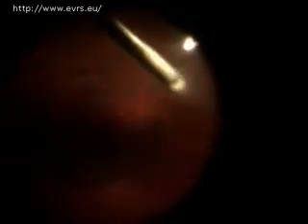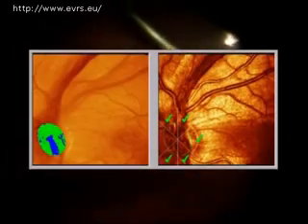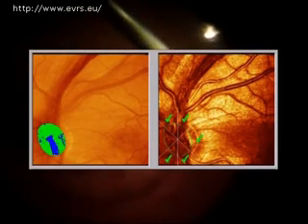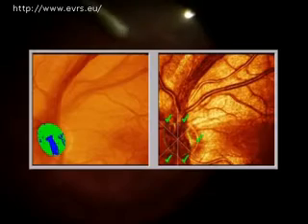In this next case, bilateral Terson syndrome is again present. After vitrectomy, we see complete ILM detachment over the macula. A postoperative HRT picture suggests that blood entered the eye along the upper vascular arcade and detached the ILM centrally. We suggest that following this, blood appeared through imbibition into the vitreous cavity.